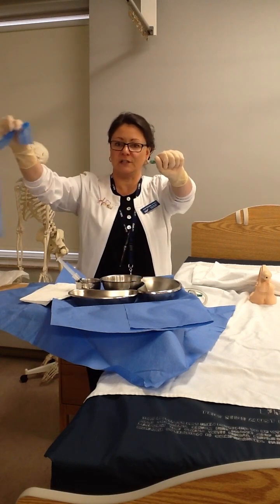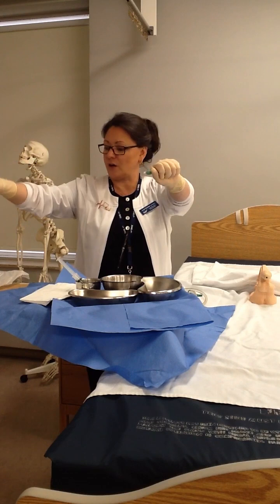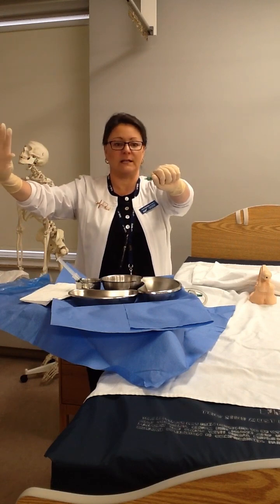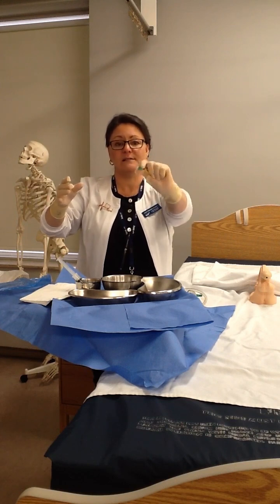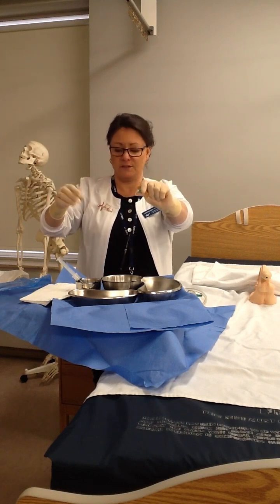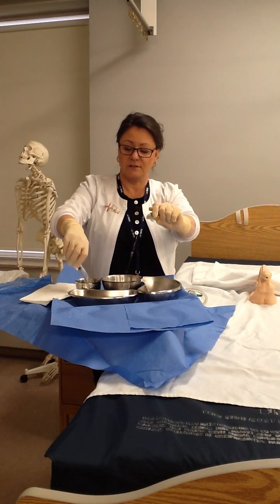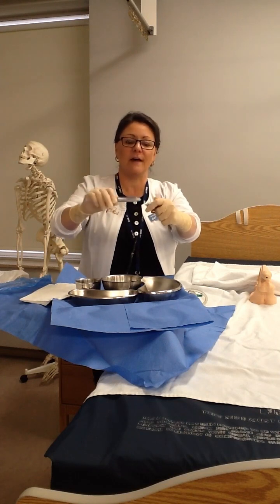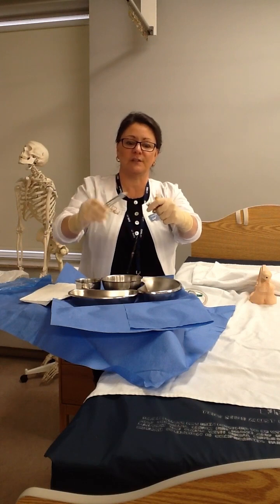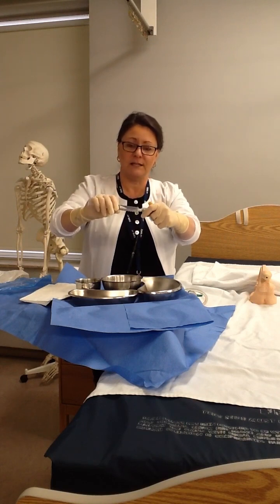This blue package, it's sterile, it's not hurting anything. Just drop it anywhere you want. And now I've got a good hold on these lumens. See how my thumb and my index finger are holding onto it? I'm going to grab my syringe and push that syringe on. So just try that when you do your own demonstration. Just push that on and off so you can feel that tension.